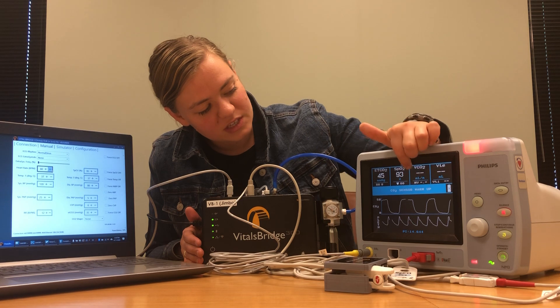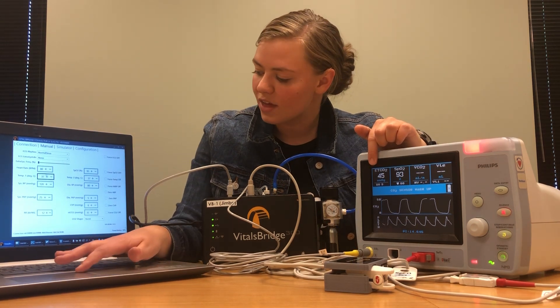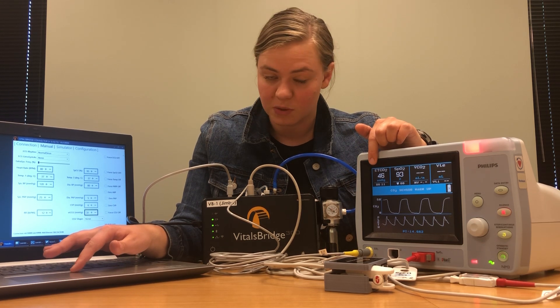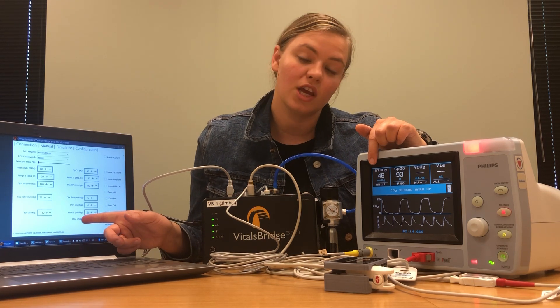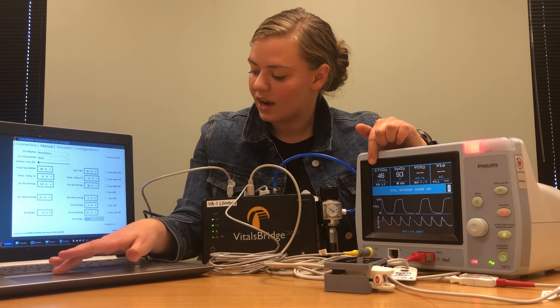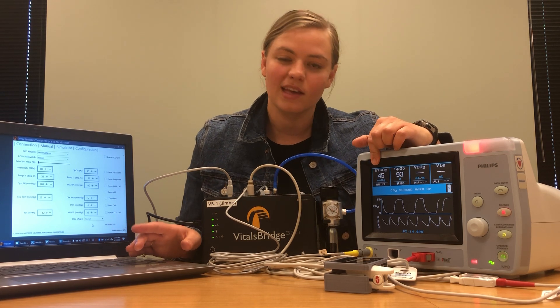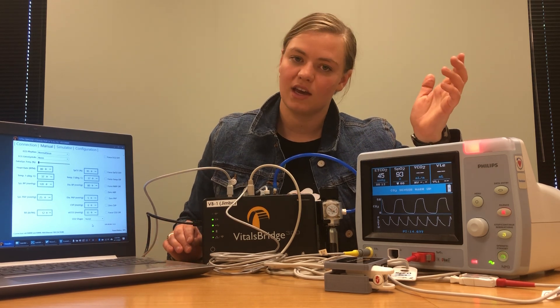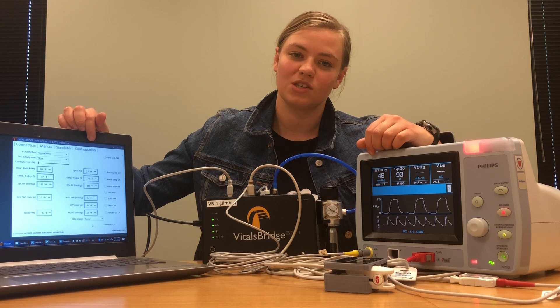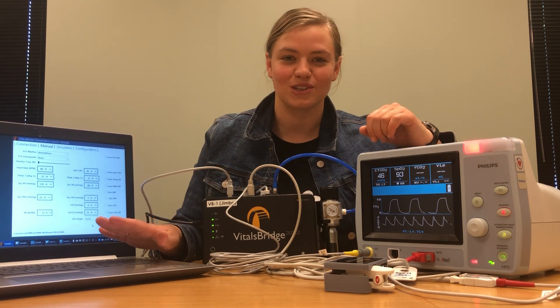You can see we've got a beautiful CO2 waveform and an ETC reading, which is exactly what we want. You can control that ETC reading from the VitalsBridge connector software, and you can also control the shape of your CO2. You'll notice the number that I have in my connector software doesn't exactly match the number on the patient monitor — that's okay, it's another thing that's easy to fix via calibration. Come up to the configuration tab and perform a CO2 calibration. Instructions for how to perform those calibrations can be found on vitalsbridge.com.